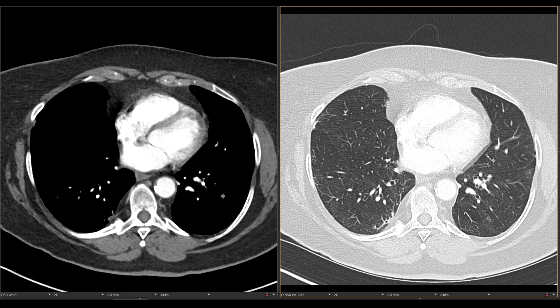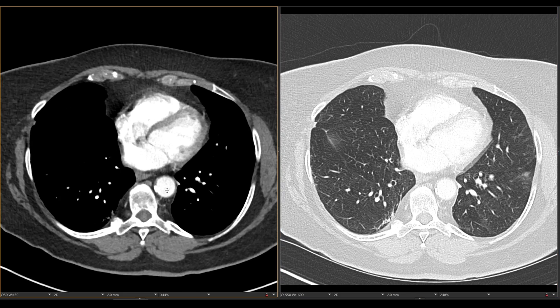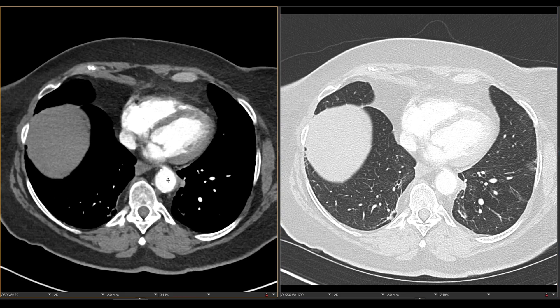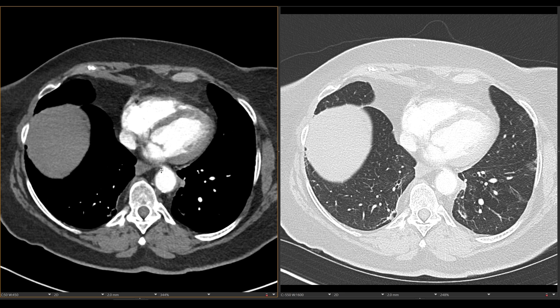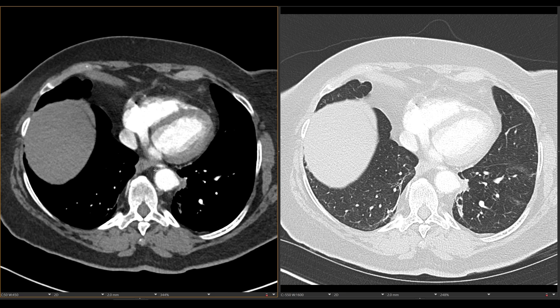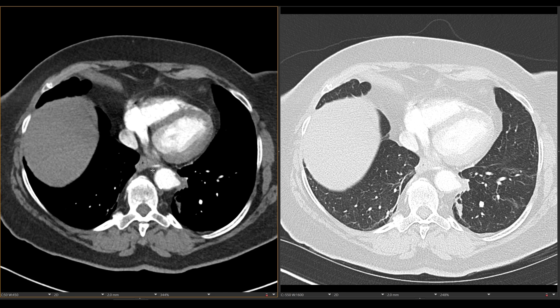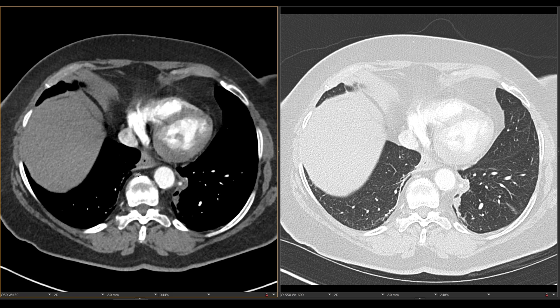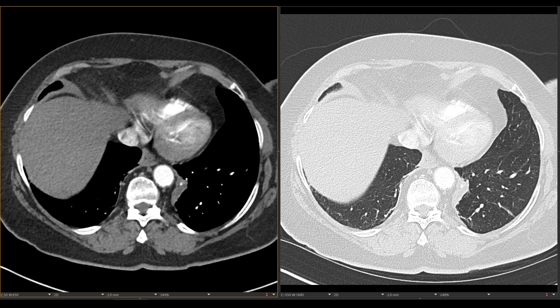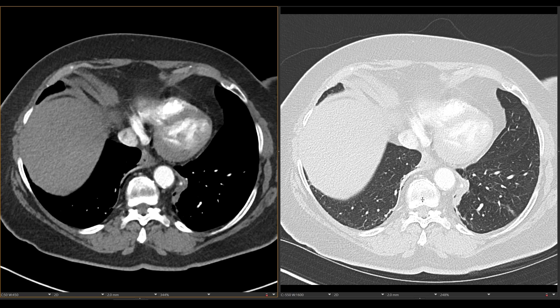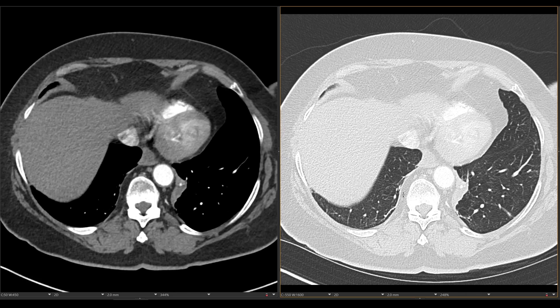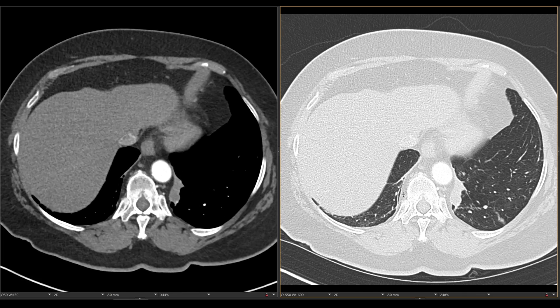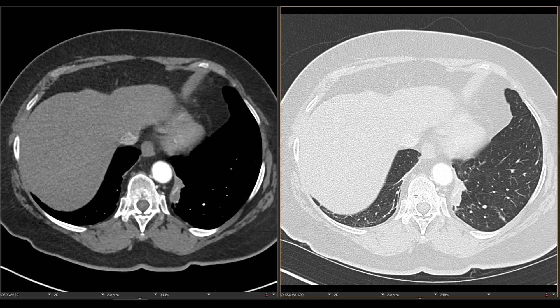This is a unique case because if you look further on the soft tissues, you can see that there is another vessel that arises from the anterior aspect of the aorta, and it goes to the right side behind the esophagus and into the right lower lobe. So in this case, there are bilateral intralobar bronchopulmonary sequestrations.